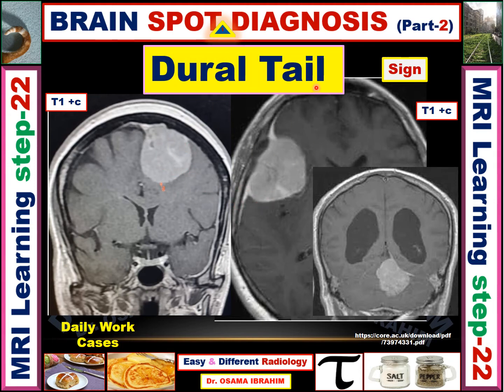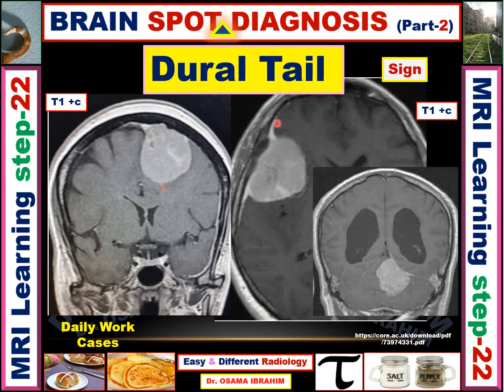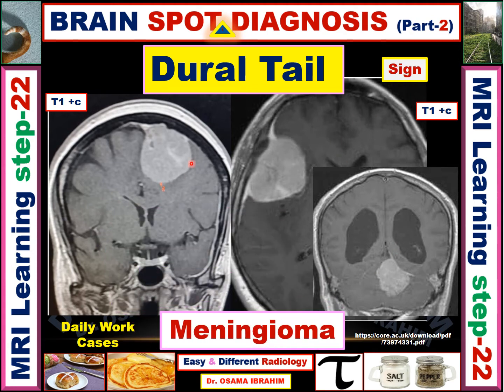The sign appearing here is the dural tail sign. We see an enhancing mass showing homogeneous enhancement and also a dural tail related to the dural-based regions in different sites. For example, this region is a tentorial site, representing a tentorial meningioma. This is a convexity meningioma with a dural tail, and this is another meningioma in the convexity. The dural tail sign represents meningioma in different places or sites.